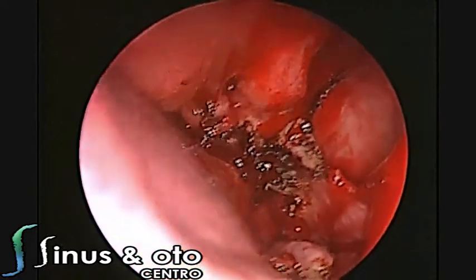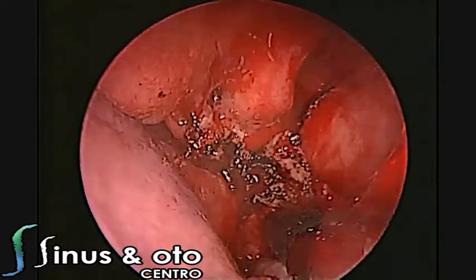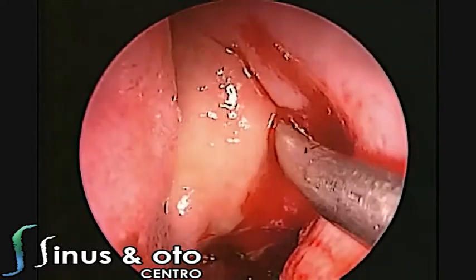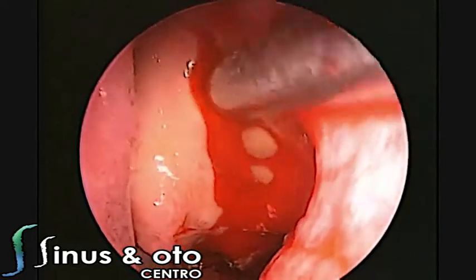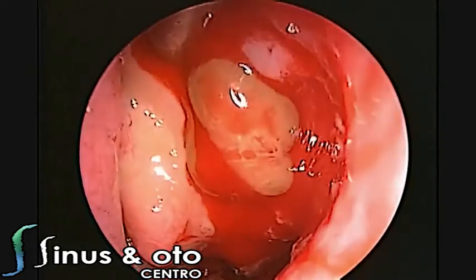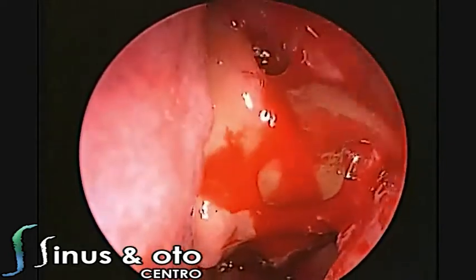After we remove the middle turbinate of the left side, you have a very big cavity — a landmark for the mucocele in order to spare the orbit.